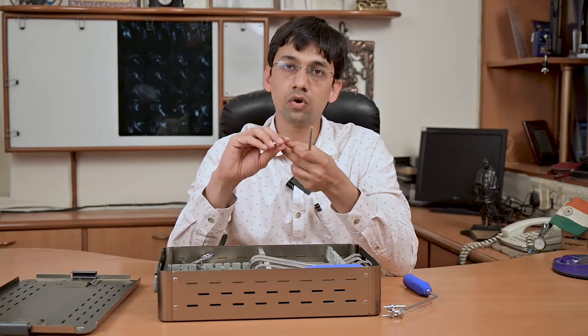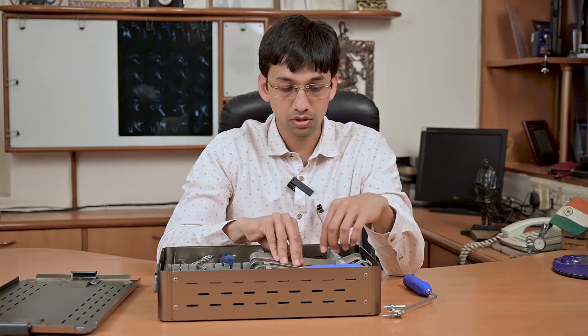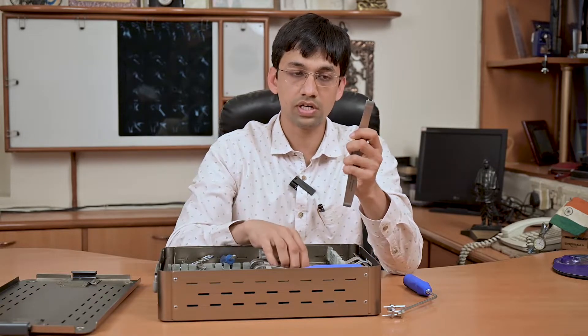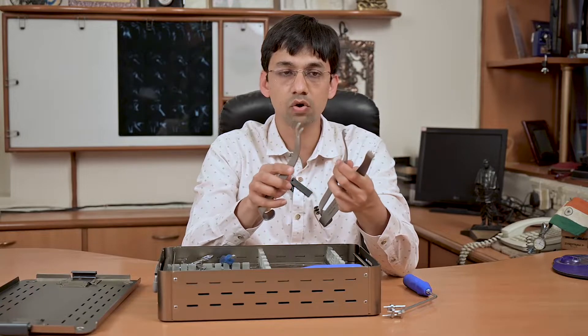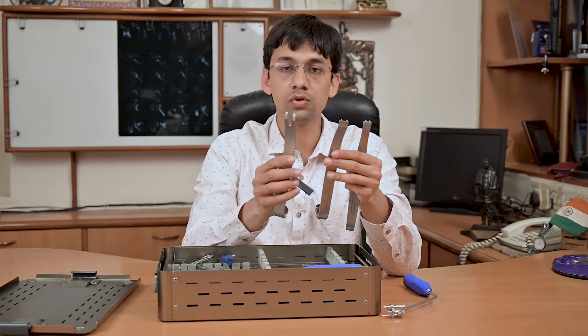The advantage of this guide wire is that it is serrated from the tip, so while drilling, it will stay in place and not advance further posteriorly. For glenoid retraction, we have three different types of glenoid retractors — one is 15 millimeter, another is 18 millimeter, and the third is 22 millimeter.